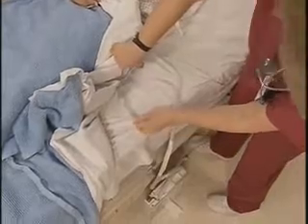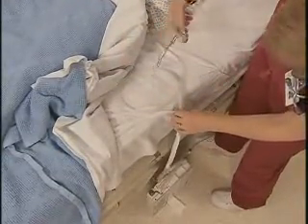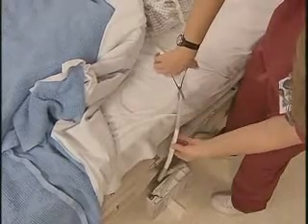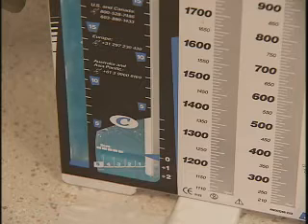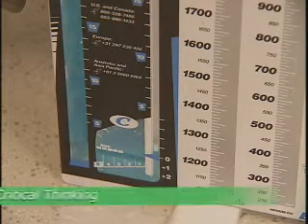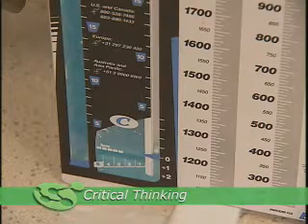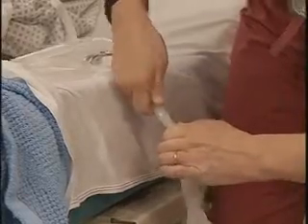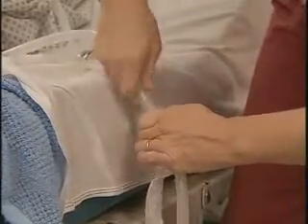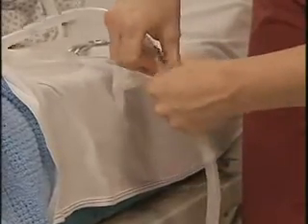If the bubbling persists, apply the clamp at close intervals, moving along the tubing toward the drainage system. When the bubbling stops, suspect an air leak proximal to the clamp. That's because placing a clamp between the water seal chamber and the air leak blocks the air that causes the bubbling. Depending on the air leak's location and cause, remedy the problem by tightening loose connections or replacing the drainage system.